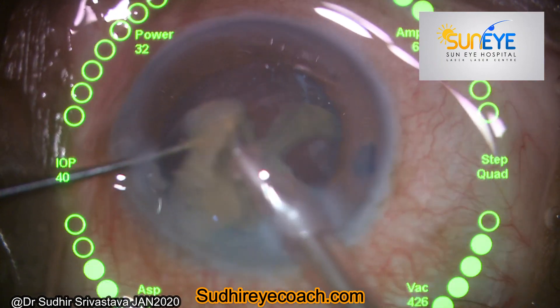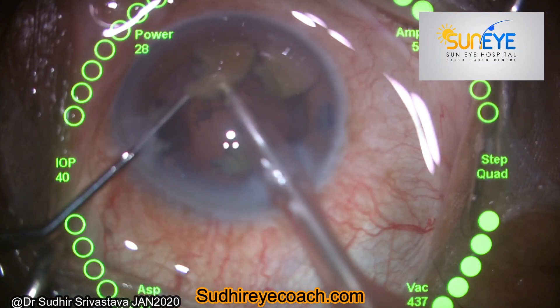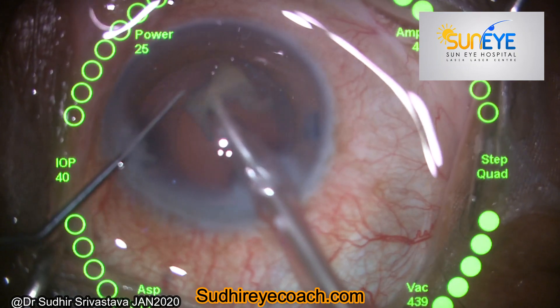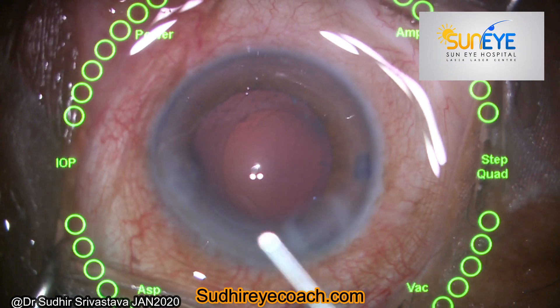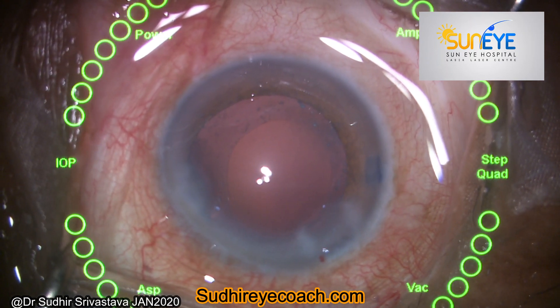This patient had capsular weakness in the inferior part, so I reduced the intraocular pressure during surgery — you can see it is reduced to 40 mmHg. If you are using a gravity-fed system, you can reduce the bottle height to achieve safe phaco fragmentation.